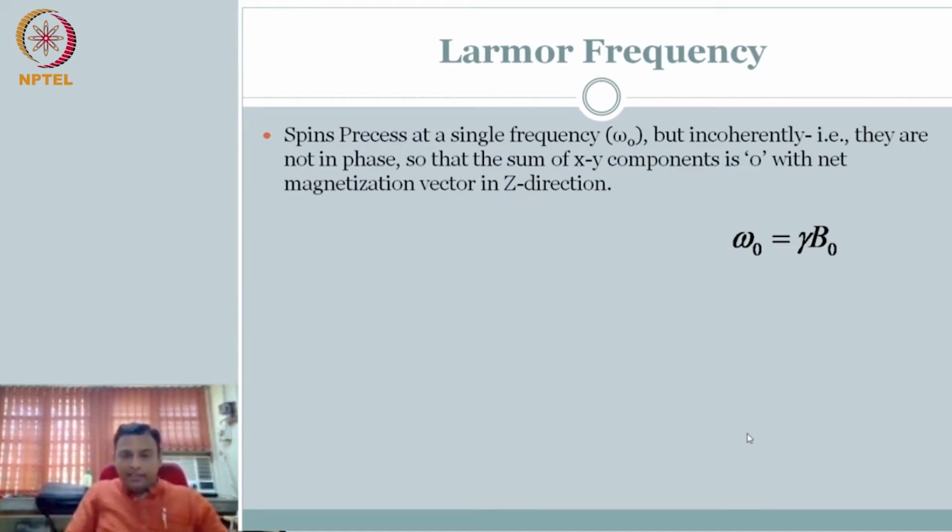So the moment I say that, each of you are initially at a different direction, so the net vector is 0. But now I have instructed you to all align along the direction going from floor to roof. This is akin to applying an external magnetic field in the plus z direction.